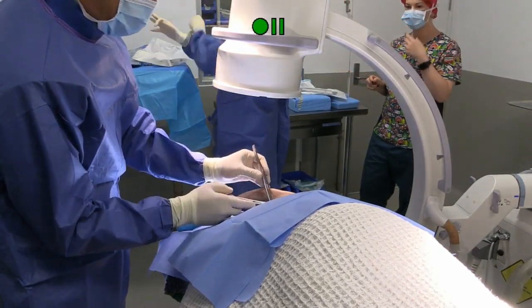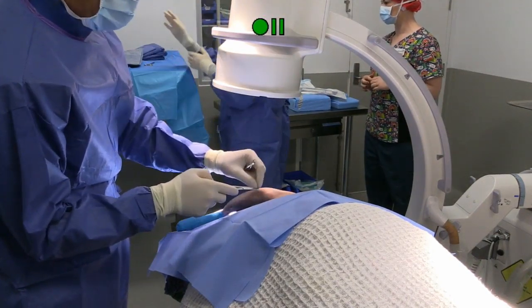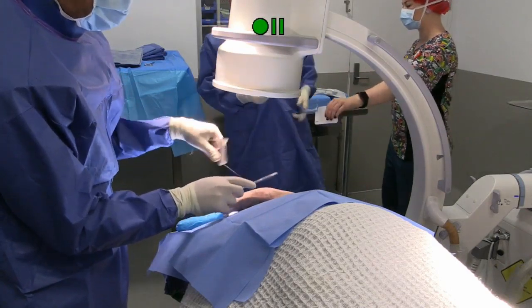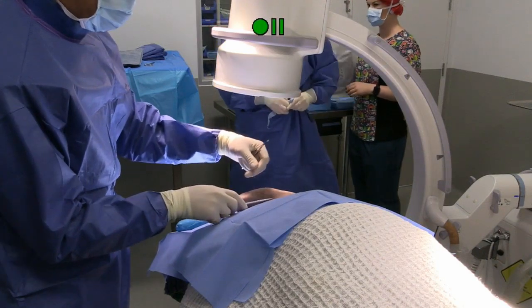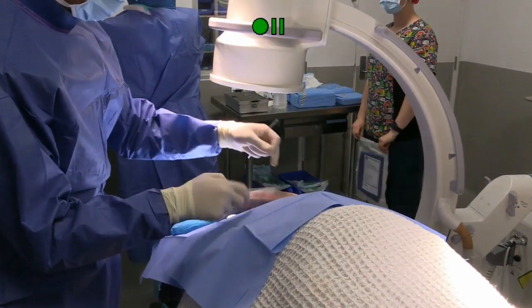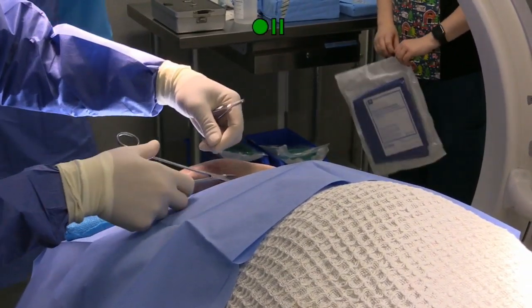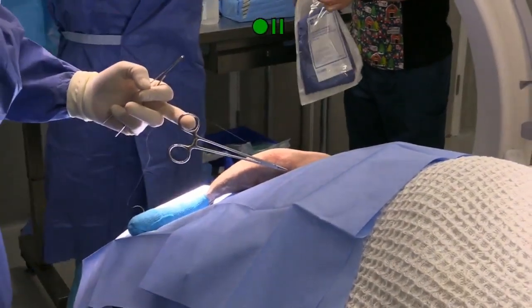So I'm just placing some sutures in the corners of the quarter drapes right now, instead of using towel clamps. One of the reasons I don't like to use towel clamps is that they're metallic, and so when we're using fluoroscopy, they can impact the image processing and make it a little bit hard to see the image you want to look at. So we use suture material that doesn't interfere.